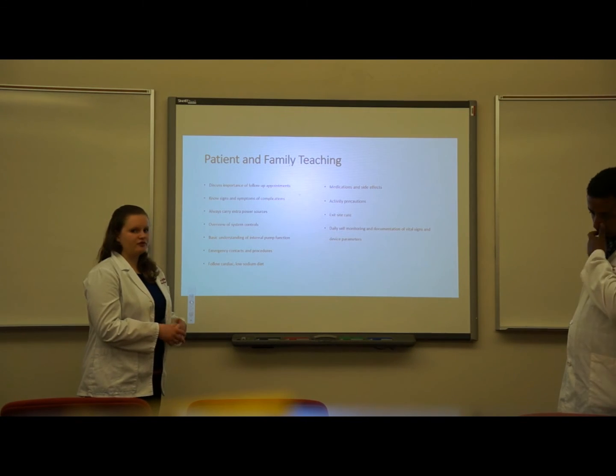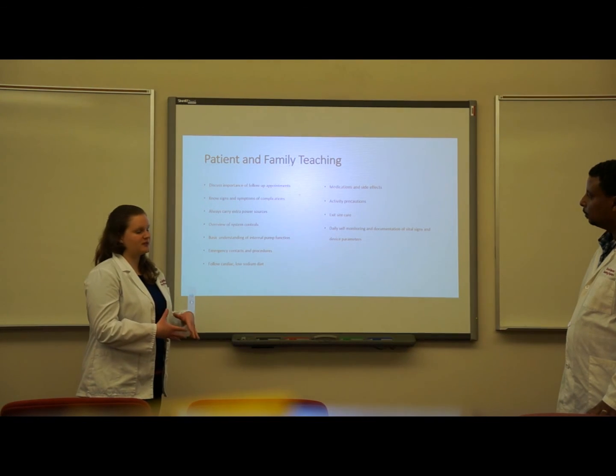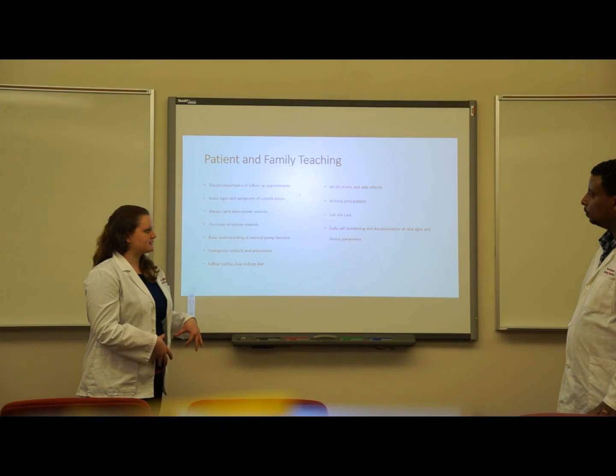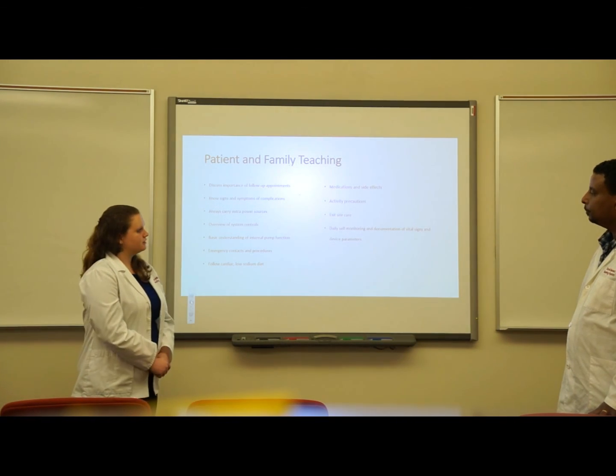They should know their physical activity precautions, such as don't submerge the device in water or don't participate in contact sports. They should understand how to care for their exit site, and they should also be doing daily self-monitoring of vitals and the system parameters.